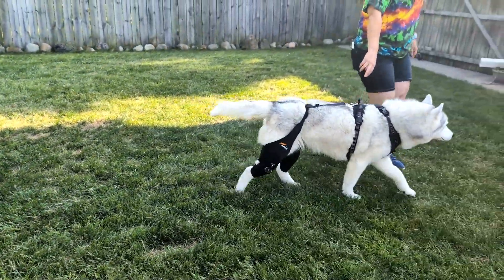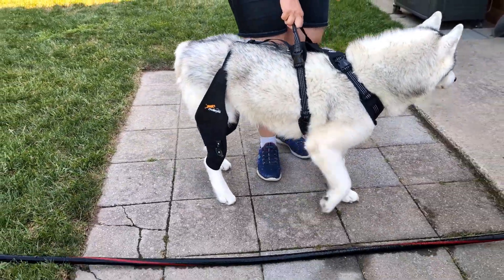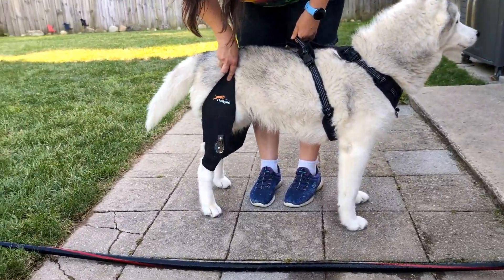On days when Memphis needs some extra support and stability for her knees, this is going to come in really handy. If you've been looking for a nice supportive dog knee brace, we recommend this.